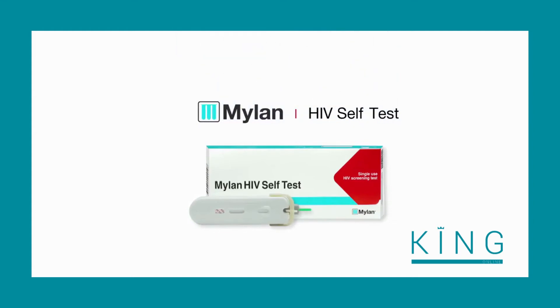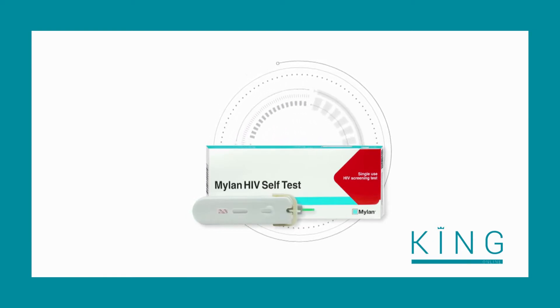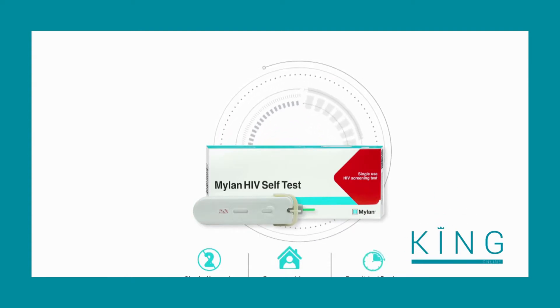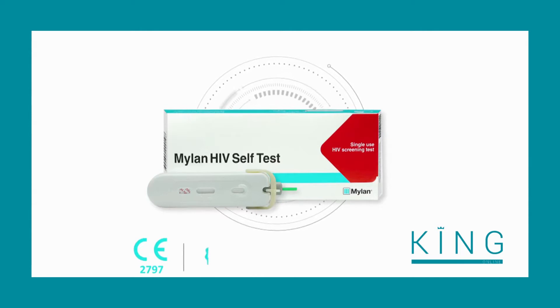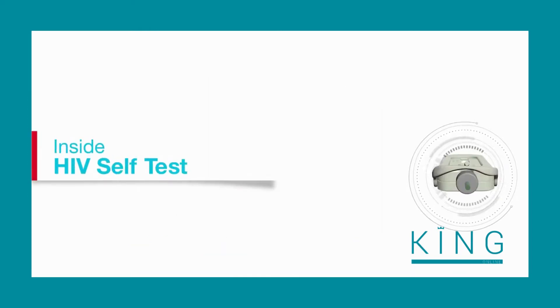Thank you for purchasing the Mylan HIV Self-Test. This video will take you step by step on how to use it. The Mylan HIV Self-Test is the world's only integrated single-use self-test device, designed as an at-home screening test with results in just 15 minutes. It is CE certified, pre-qualified by WHO, approved by TGA, and is a safe, convenient, and accurate way of screening yourself for HIV with just one drop of blood.